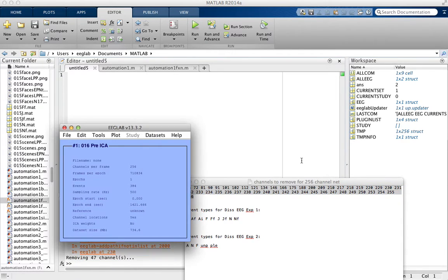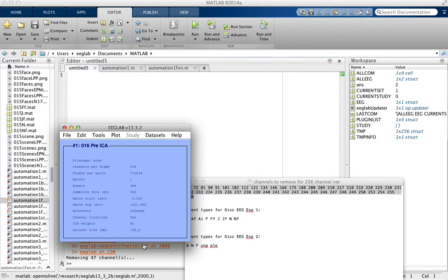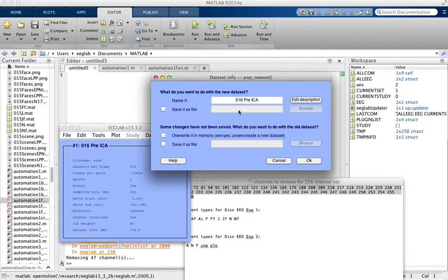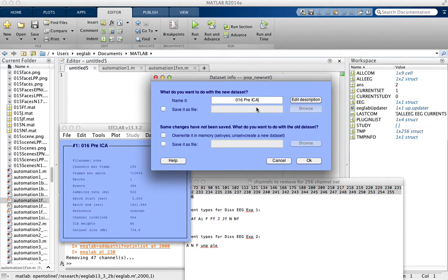Click OK. And then it's going to create a new data set in EEG Lab. And you can rename it. So we can say Channels Remove.